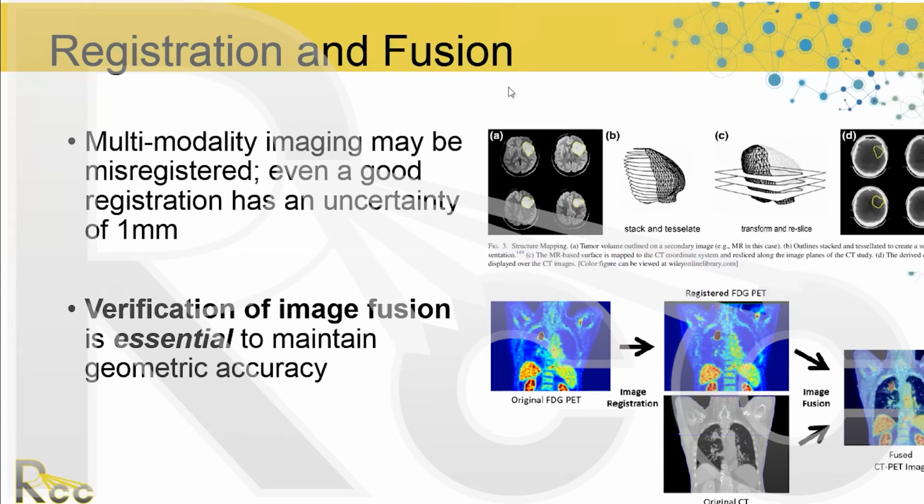For liver, and pancreas is probably the other one, it's tricky because there's diaphragm movement. If you're trying to align to the tumor, which is very hard because the tumor is hard to see in the liver and in the pancreas, Peter was saying that you could use the minimum intensity projection.